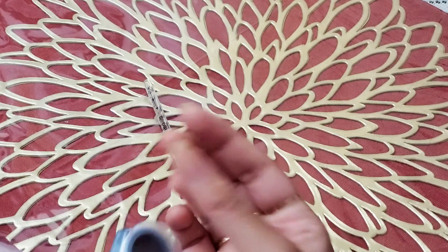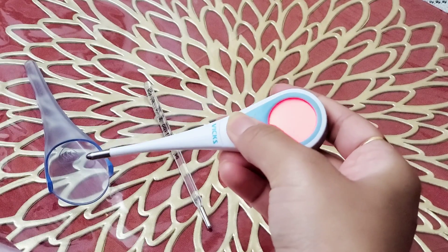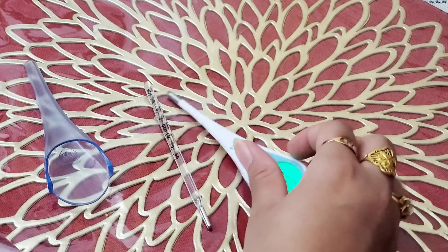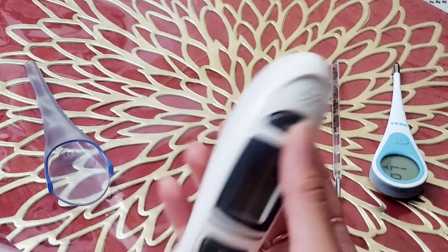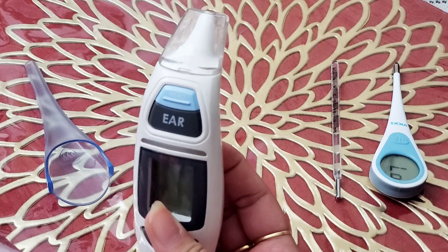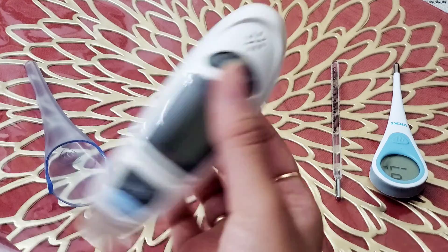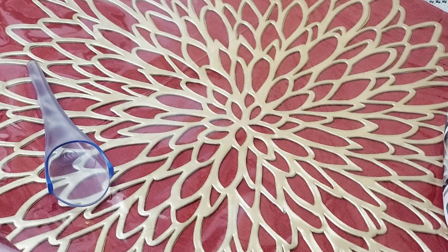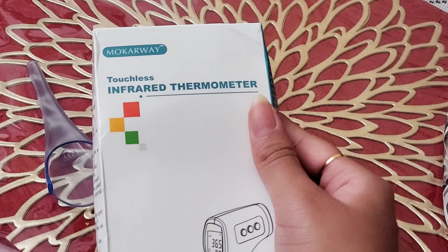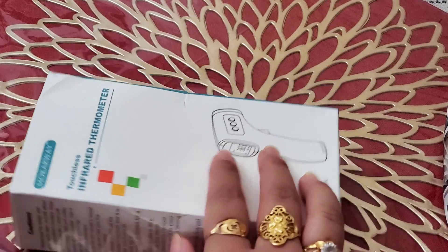So what do we use? Let's progress a few years — voila. This is a thermometer as well, except this one is digital. As you can see there has been a very steady progression. And that's not where we stop. Next we have another thermometer that is even more high-tech — this one you don't even have to have near your body. You can use your ears, your forehead, or any kind of non-physical element. What we have now is the new and latest infrared non-contact, touchless thermometer.